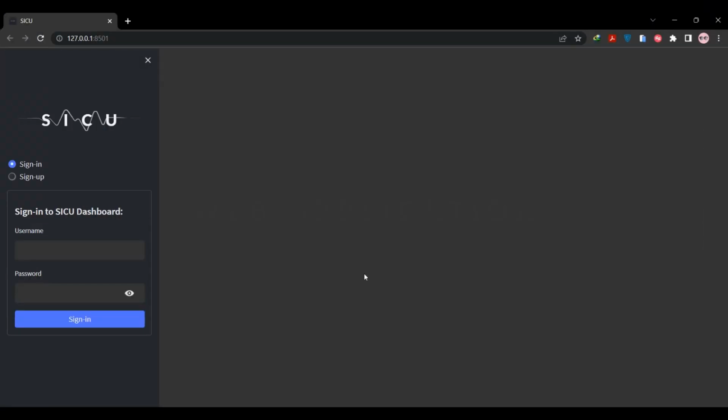By running the Streamlit web application, this page would be the first thing that you will face on the platform. As you can see, there are the same options as what we did in the Telegram bot, like sign in and sign up, and you can use your credentials to sign in, and also you can sign up again into the platform using an organization name and a password. Here we're going to use the username and password that we previously used in the Telegram bot to create an account, and we're going to access the private area.